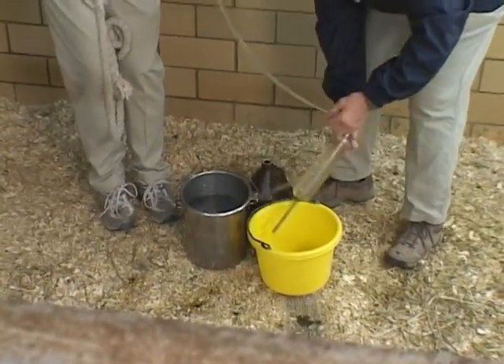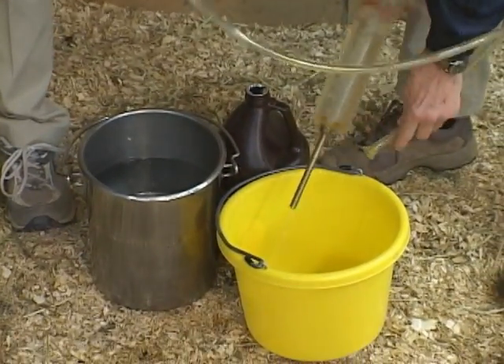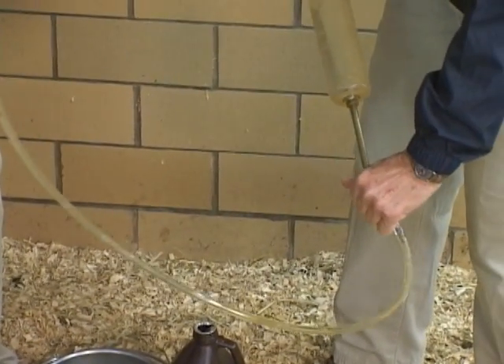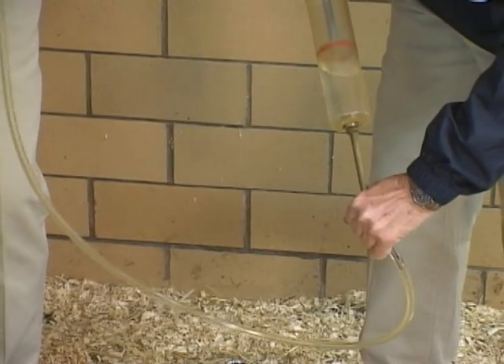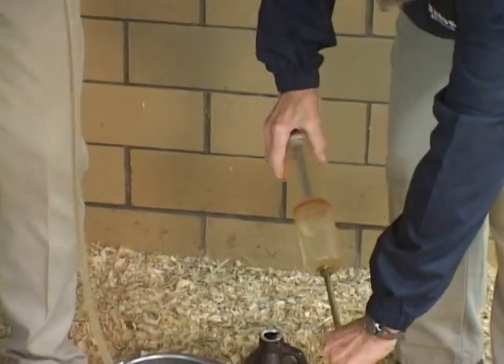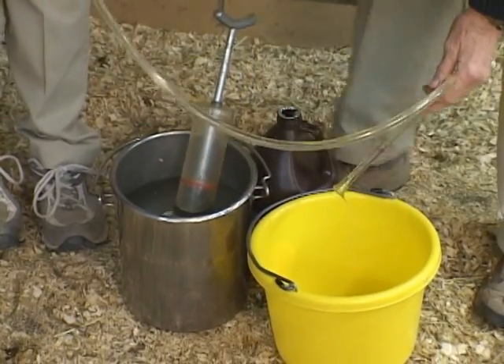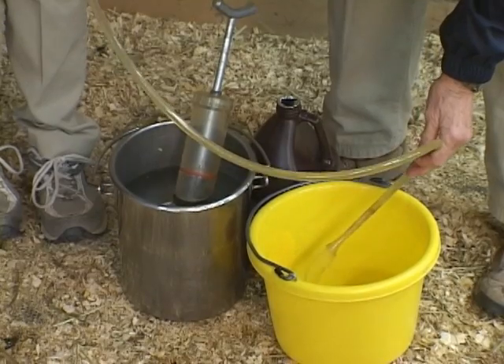In a colic that's really at the front end of the GI tract, it can be impressive how much gastric contents you can get out — they can have a buildup of a couple of gallons; they would fill that bucket right up. Technically all you're doing is establishing a siphon. Sometimes we play a little bit with that tube — pull it out a little bit, push it in a little bit — to try to get that siphon going.